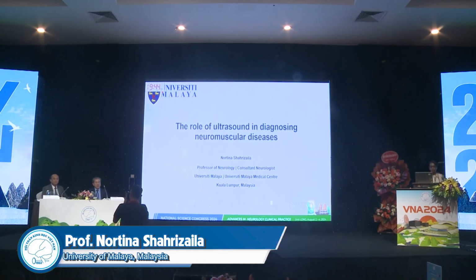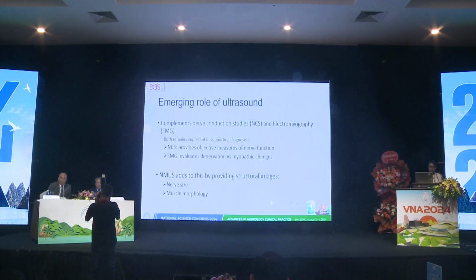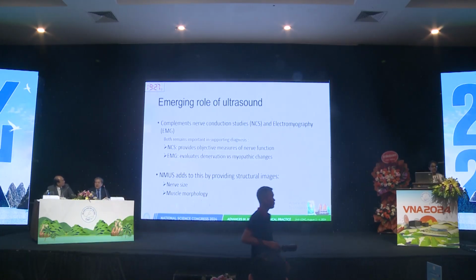So I'm going to talk to you today about the role of ultrasound in diagnosing neuromuscular diseases. I don't have any disclosures. Some of you were at the workshop yesterday, and you would have heard or read that now, especially in neuromuscular diseases, we're not relying just on nerve conduction studies and electromyography.